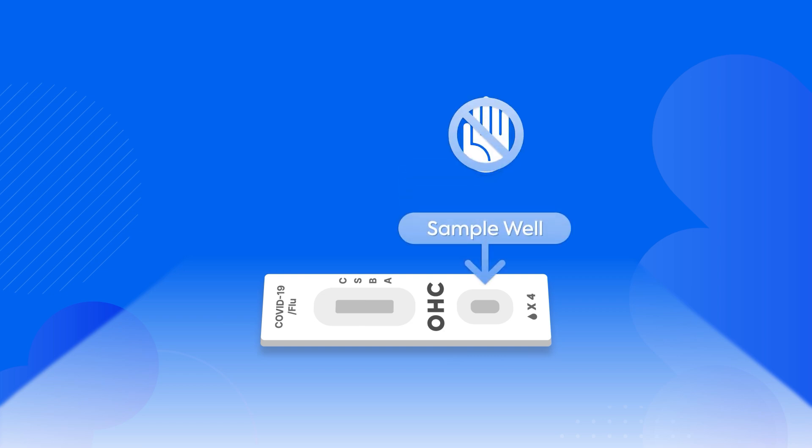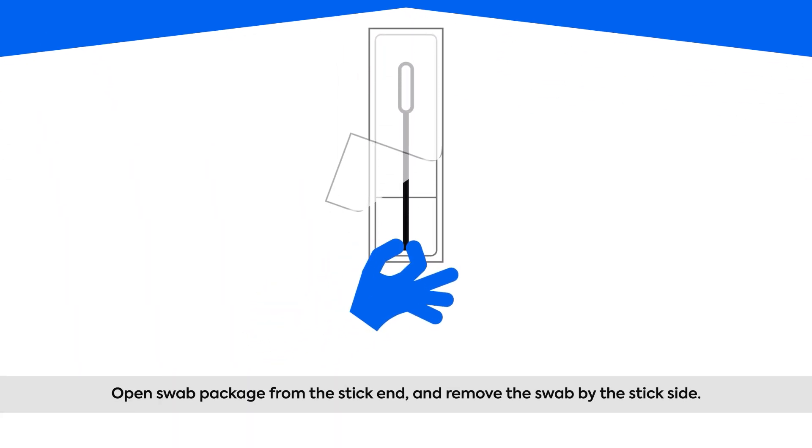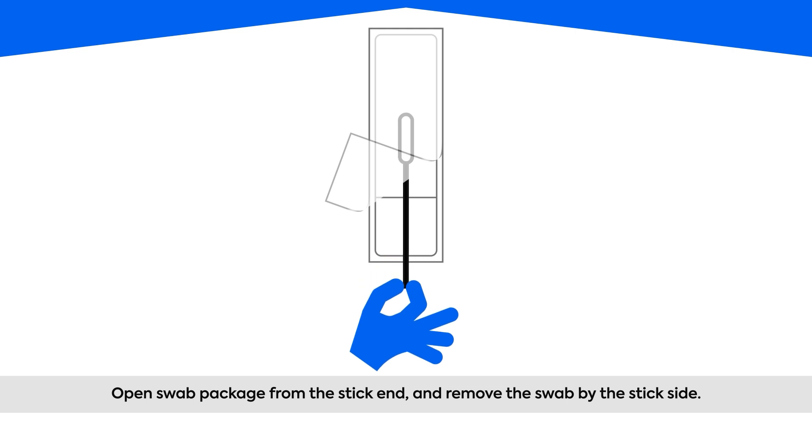Make sure you do not touch the sample well of the cassette. There are two oval indentations on the cassette; the smaller indentation on the bottom end is the sample well. After you have completed the necessary preparations to conduct the test, open the swab package from the stick end and remove the swab by the stick side. The paper and plastic pouch peels apart at the thinner stick end of the swab.